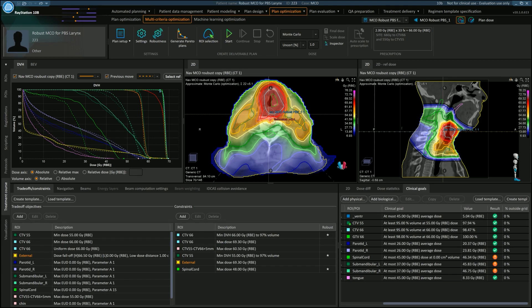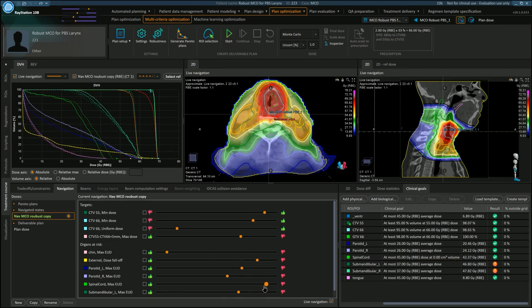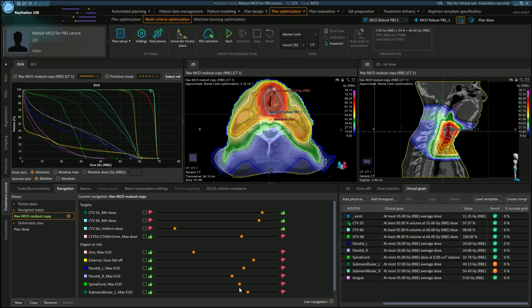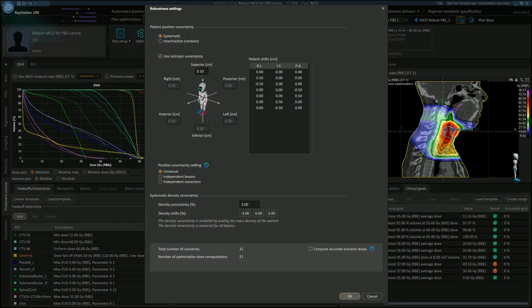In radiotherapy planning, we often come across difficult cases where we have to make a compromise between target coverage and optimal organ at risk sparing. With the unique multi-criteria approach implemented in RayStation, we can generate a Pareto front where we can explore these trade-offs in real time. Looking at our current patient, the spinal cord goal is outside of tolerance. To lower the dose to the spinal cord, I simply pick up the slider and move it towards the green thumbs up. In real time, looking at the DVH, the 2D views, and the clinical goals, I can see the effect on the spinal cord, the targets, and other organs at risk. In proton planning, our constraints in the multi-criteria solution can also be robust to the uncertainties defined in the robustness settings.